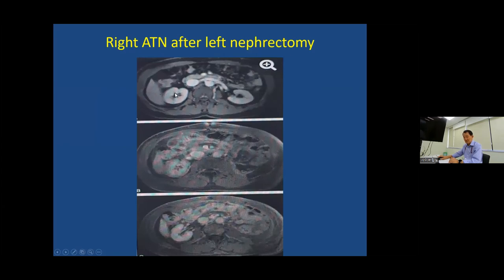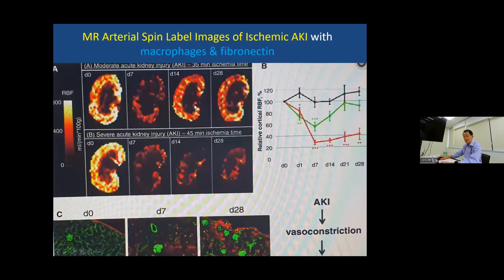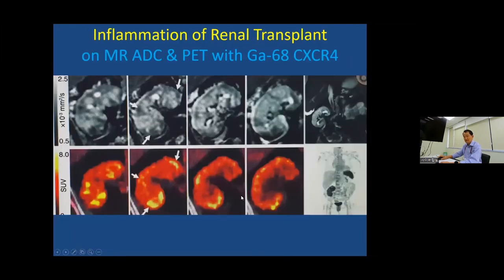the contrast agent here is retained here. So this is interstitial nephritis or acute tubular necrosis. Okay, this gadolinium normally washes out. This cisplatin is tubular. Usually platinum is toxic to tubular cells. And so it's only cortex here, nothing in the collecting system. So MR, certain techniques, can show other things, inflammation, using all these chemotoxins, toxic agents, it shows certain inflammatory portions.